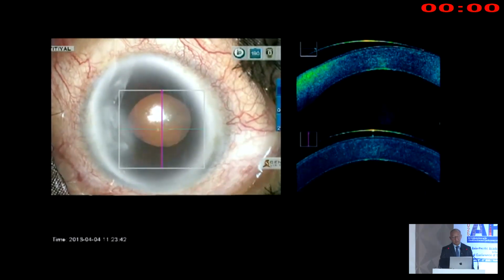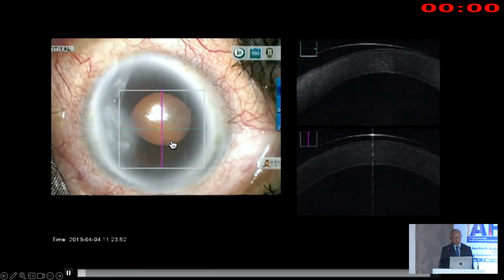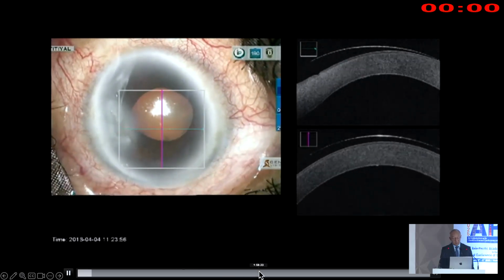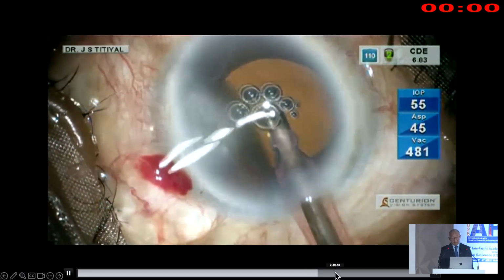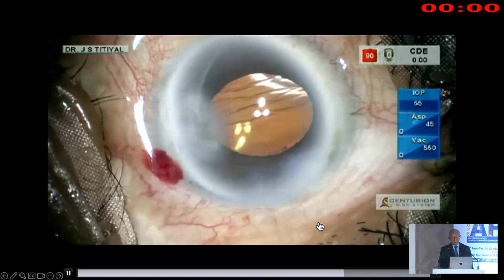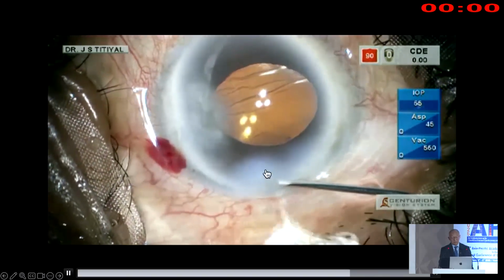which can extend also. This is another classical video I have from one of my patients with an endothelial compromise case, a Fuchs case. I've done a phaco effectively in this patient, with the hazy cornea, implanted the IOL monofocal lens. And when I was doing hydration in this particular case, I realized this is one side, this other side. A little bit of frill I could see when I did hydration here.